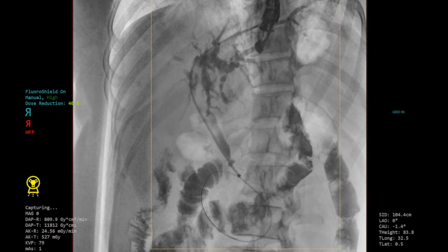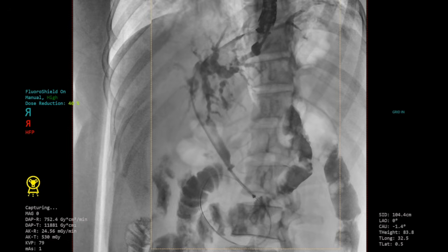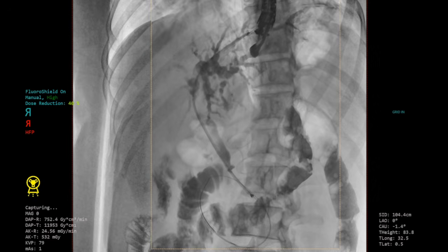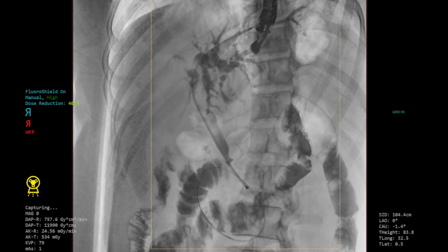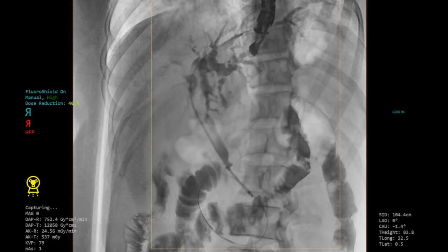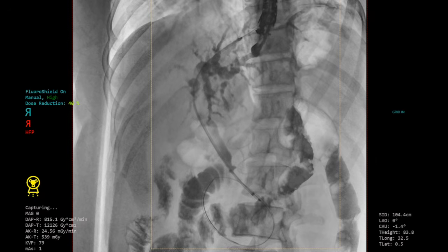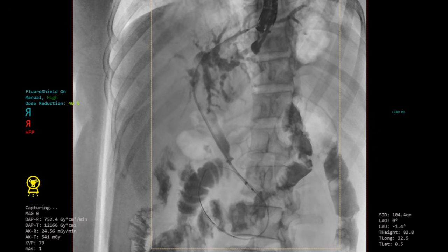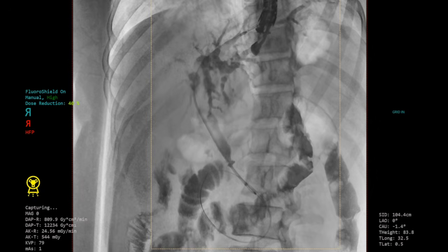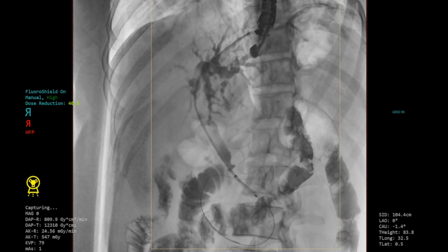Continuous suction should be applied and the guide wire should be anchored tightly at the elevator so that there is minimal bile leak and pneumoperitoneum. The stent of correct choice should be kept ready before the balloon is withdrawn into the instrument channel. For antegrade procedures traversing the liver hilum, always use an uncovered metal stent. For hepatogastrostomy, a partially covered or fully covered stent may be used based on regional availability. The endoprosthesis chosen should preferably be 8 mm or less in diameter, as they are flexible and easier to navigate.